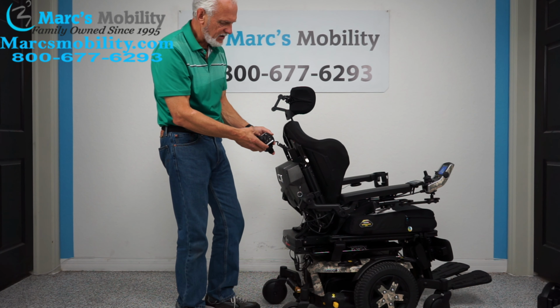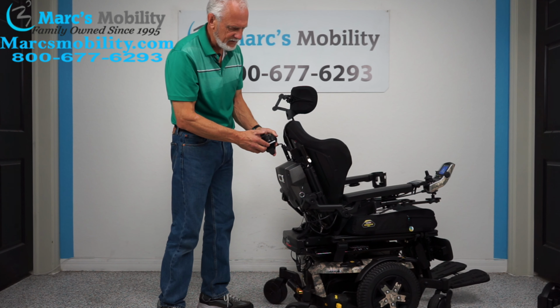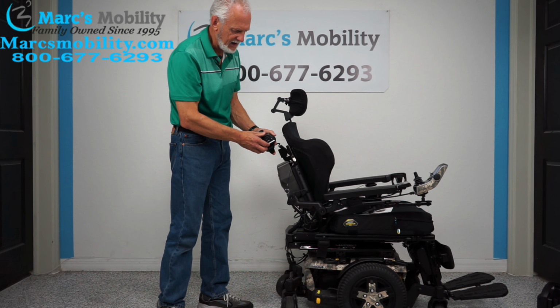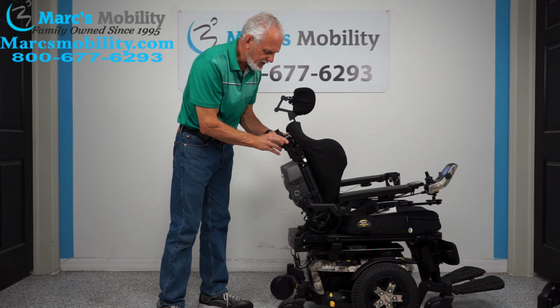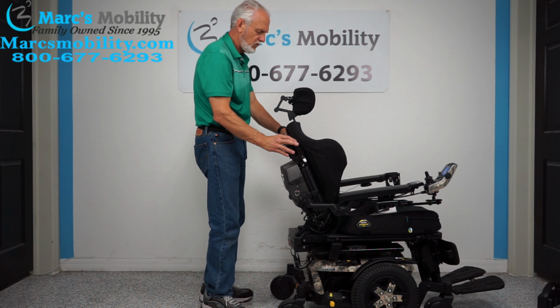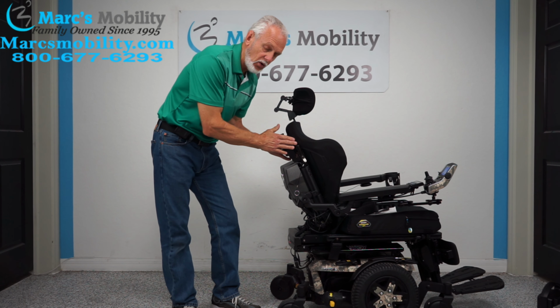So I can back up the chair. I can go forward. I can turn right or I can turn left. I can also do the seating. All that can be done here. You can leave it on here. You can drive it this way with one hand, so this is called an Attendant Control. It's already here on this chair.